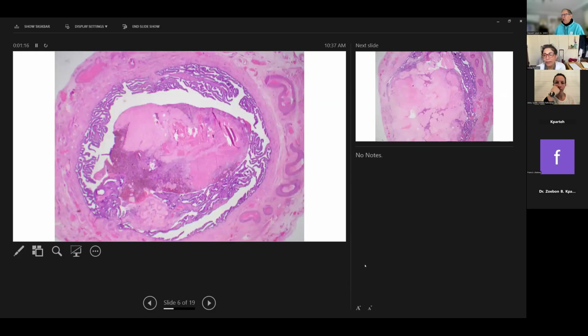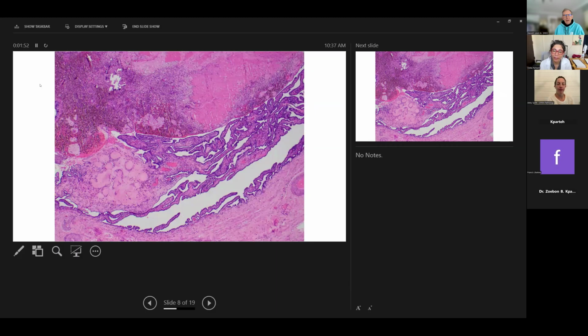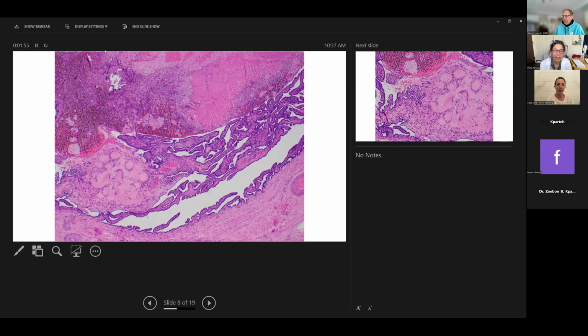Looking around a little bit further, in deeper sections, we had an intraluminal fibrinoid and hemorrhagic area. And then down here at the lower portion, you've got an almost vaguely granulomatous-like appearance, or at least some cells around pink structures there. I started wondering, oh, is this a granulomatous salpingitis or something of that sort? But then it looked a little bit more fully, and you began to see these very hyalinized pink nodules with some surrounding areas. There's a high power view of that one that looked vaguely granulomatous.